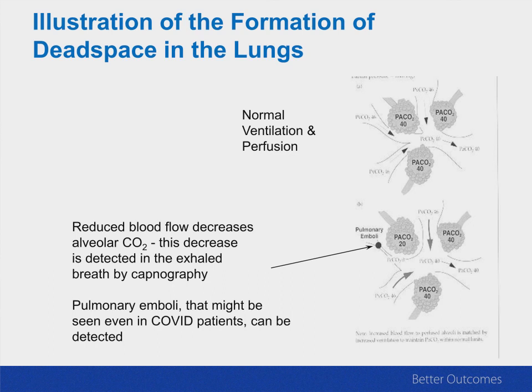One of the things that stood out to me when we were first looking at capnography, and we've been doing this for over 25 years, was a patient who we had just extubated and seemed to be doing fine. We had a capnogram on him, reading about 40. But he suddenly complained of shortness of breath, and his capnogram went from 40 to 10 literally in 1 second. He was having severe trouble breathing, and what he had was a pulmonary embolism.